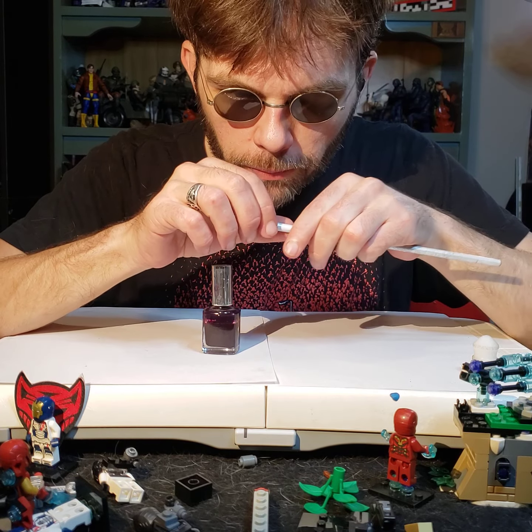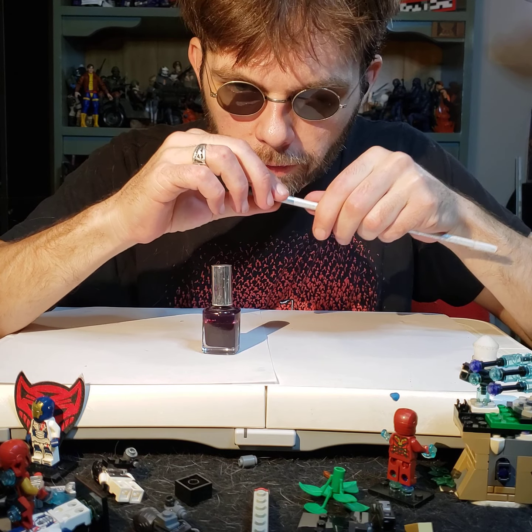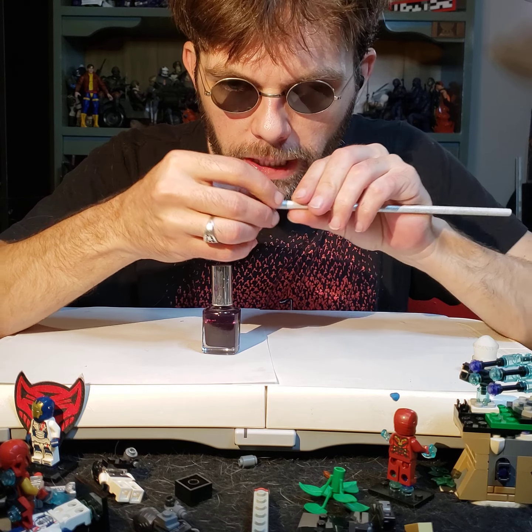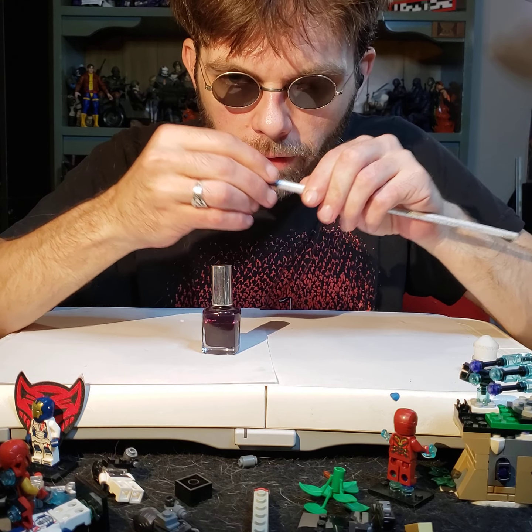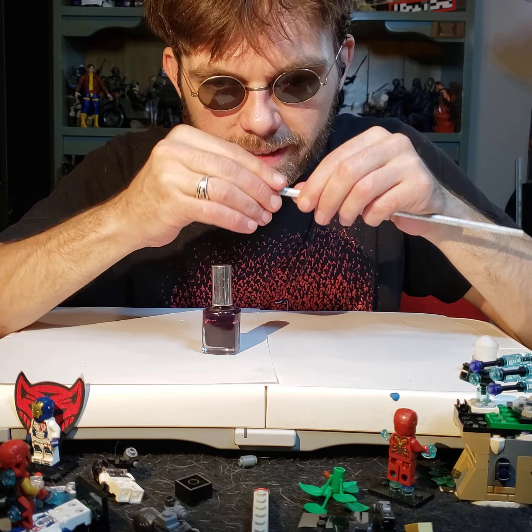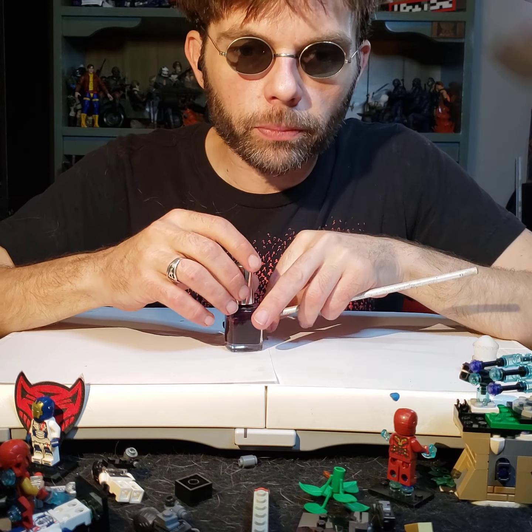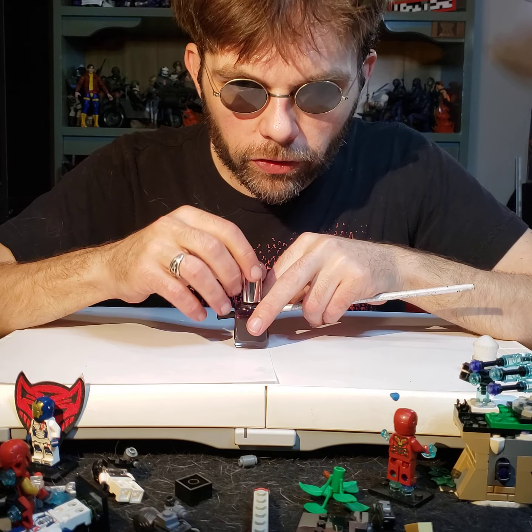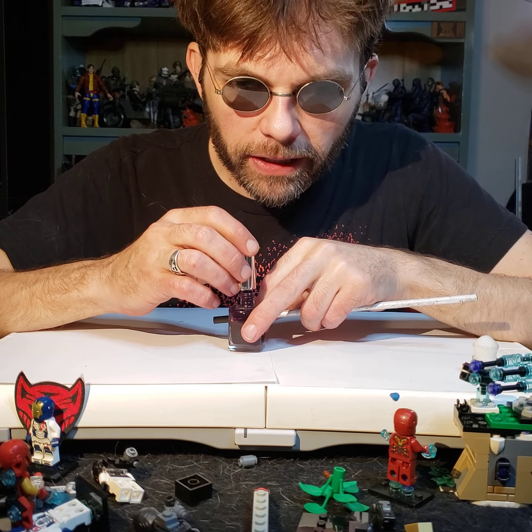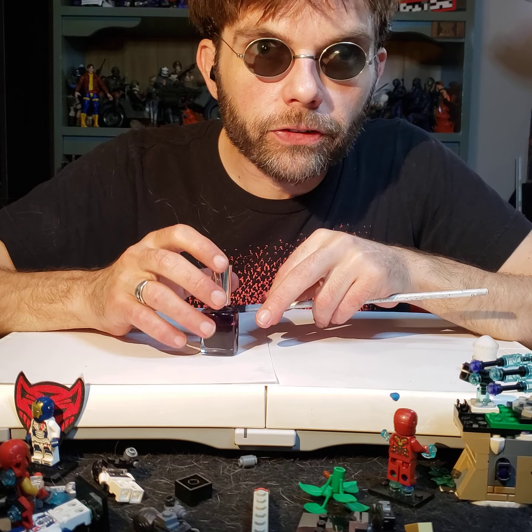Now feel with your fingertips. You can feel where the white bit of the cane ends and this area comes up that should be a very grippable surface. But for me, since I've been using this cane a lot and it rained a lot because of that hurricane, and sand got in there, it sanded it all down really smooth. Well, that's not good for me. That means this cane falls apart. And I just had it fall apart in the road, and some kind person stopped in the middle of the road, got out of their car, and helped me find my cane tip. And I was like, I've got to fix this. And then I went, oh, this is a great video.